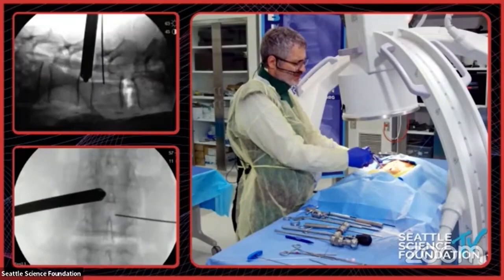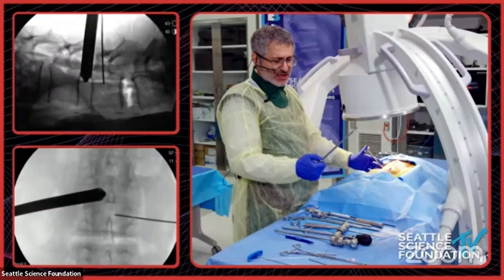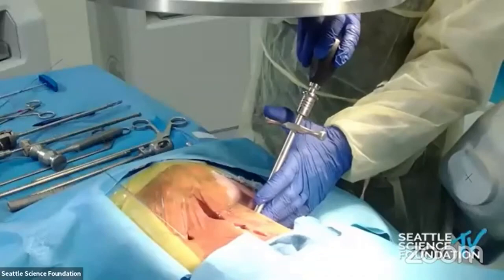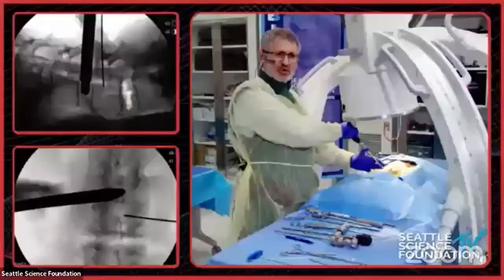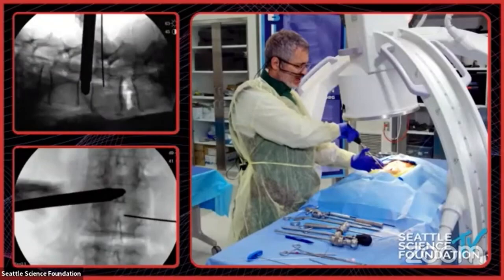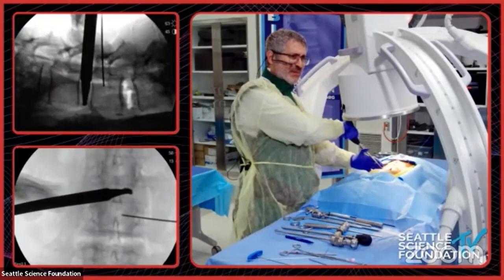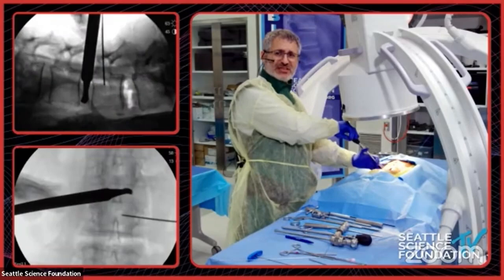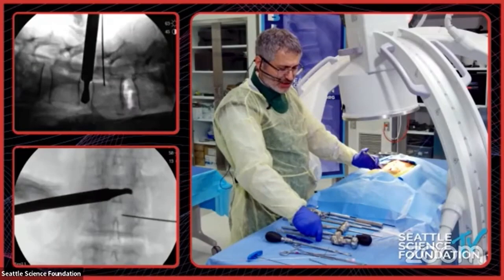The next step is going with the drill to create a space. It has markings — if the tube is in the right place, 33 millimeters is the maximum the drill can go in. I get lots of X-rays at this point. I'm controlling the tube with my hand. I pivot it back and forth, going in this direction and that direction to maximize the use, and now the space is created and I can go and take the pieces out.